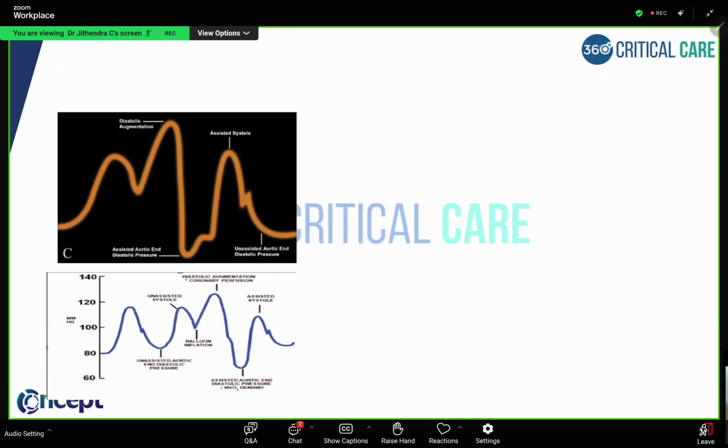Yes, anybody? Somebody said normal. No, normal is the one in blue, which is there. Somebody says early deflation, steep slope. Yes, early deflation. It was supposed to not slope like that. It was supposed to slope slowly, but it is steep.